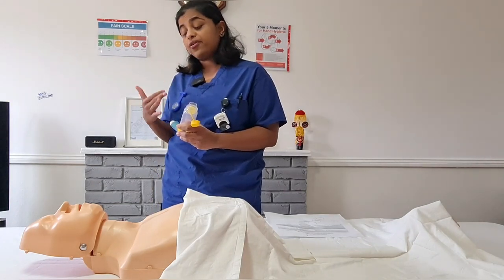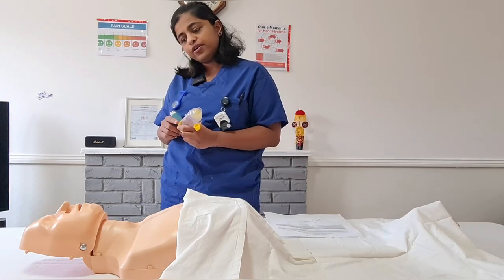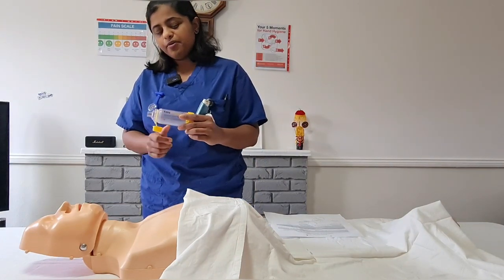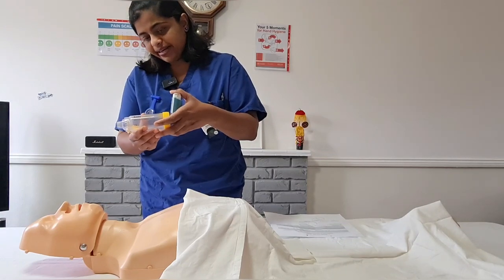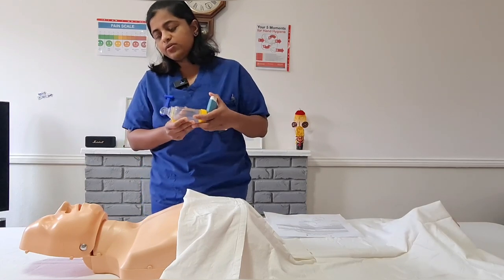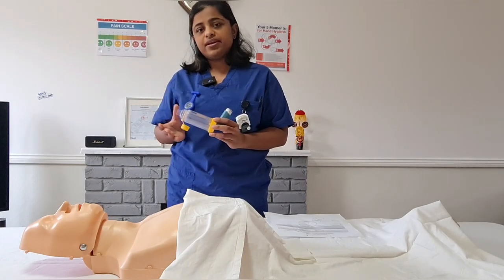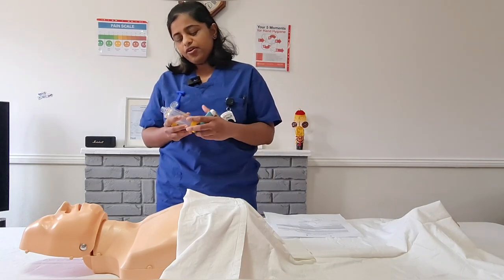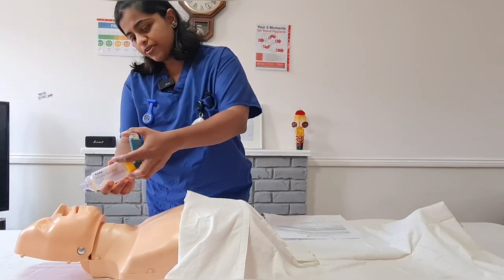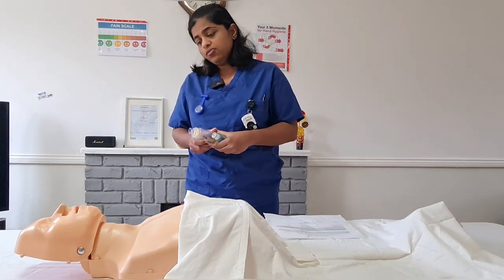I would suggest, if you cannot hold your breath for a long time, it is preferred to use the multi-breath technique. Are you struggling with your breath at the moment? Yes. Shall we go for the multi-breath technique then? Please hold it, do not bite, then depress the canister completely and take a deep breath — well done. I will now take out the inhaler and wait 30 seconds before the next dose. If it were a different drug, I would wait two to three minutes. Can we go for the next puff? Insert it into your mouth and depress it completely — well done Emma, that is your two puffs done.